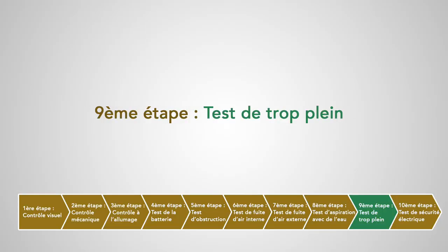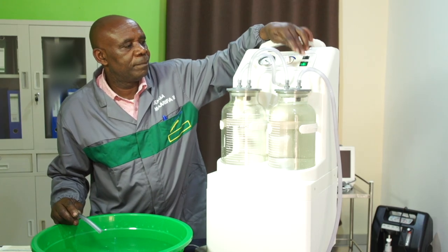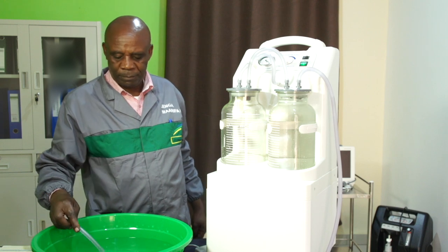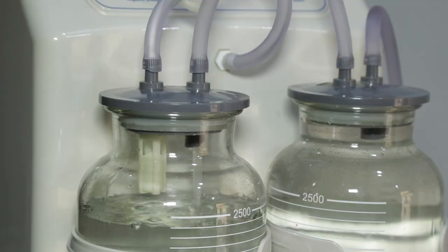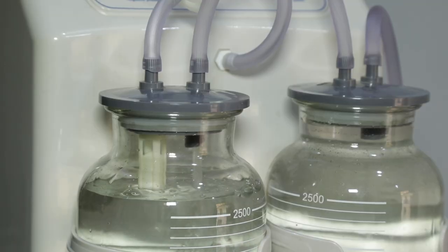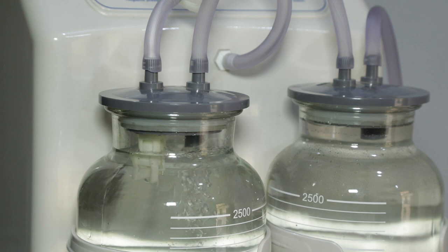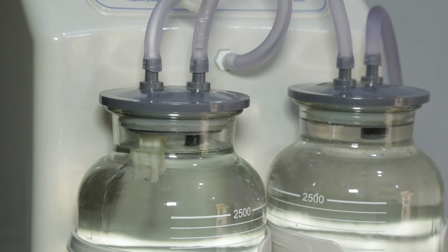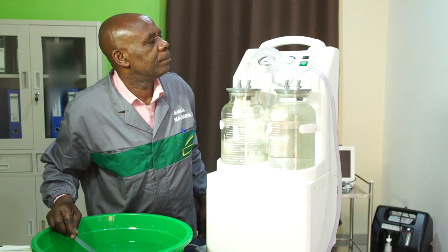Neuvième étape : test de trop-plein. On va remplir le bocal de l'aspirateur aux trois quarts avec de l'eau, puis aspirer lentement de l'eau jusqu'à ce que le bocal soit rempli. On continue d'aspirer et on vérifie que le flotteur de sécurité monte et arrête l'aspiration et l'écoulement de l'eau. Si l'écoulement ne s'arrête pas et qu'il y a un débordement dans le filtre antibactérien, il faut arrêter immédiatement l'appareil et vérifier le fonctionnement du flotteur.